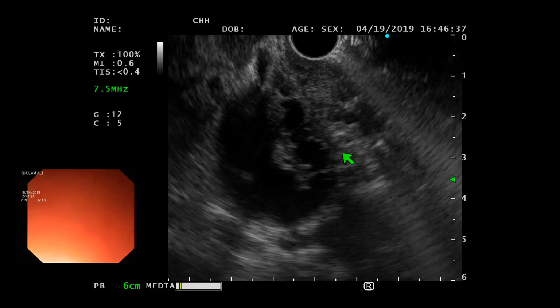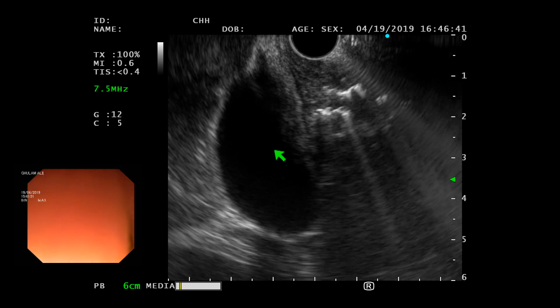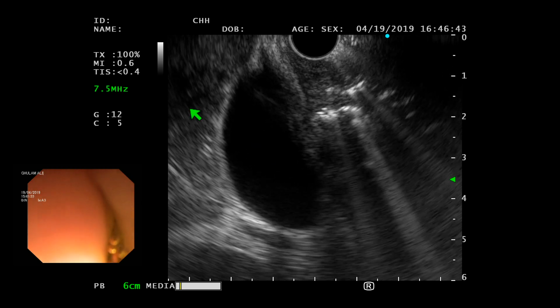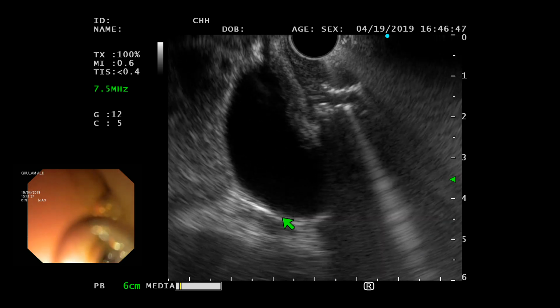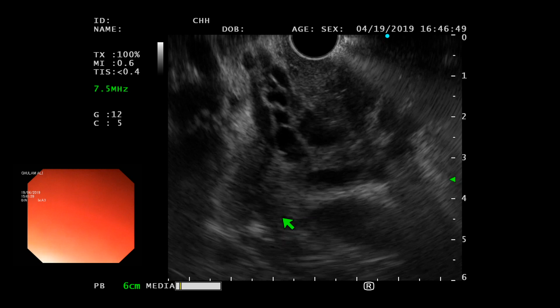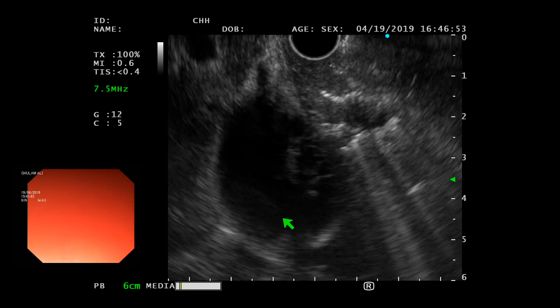So you go to the right, and you're looking at the gallbladder actually right now, and you see a liver right there, gallbladder here. No, gallbladder, if you are looking at the gallbladder there, that means you need to really rotate up quite a bit to the right to get to the pancreas.